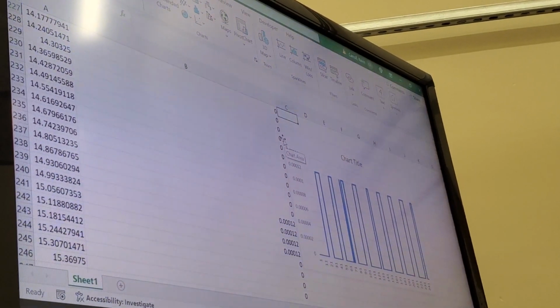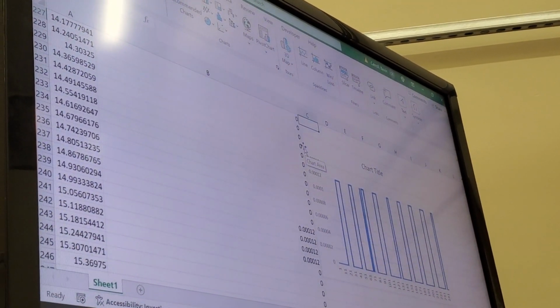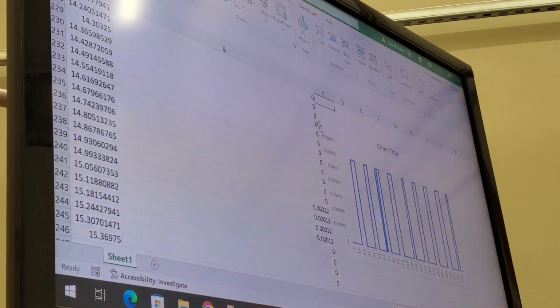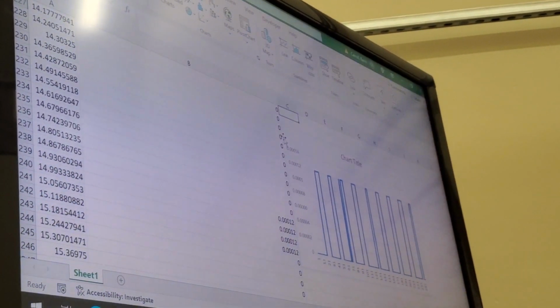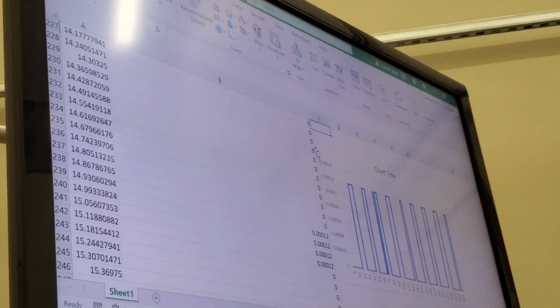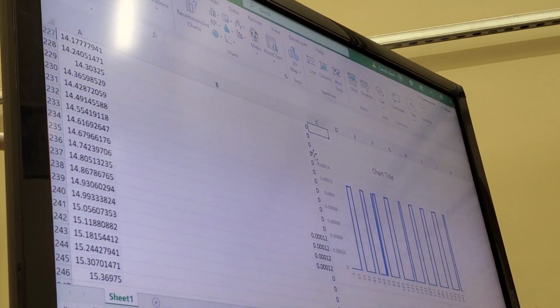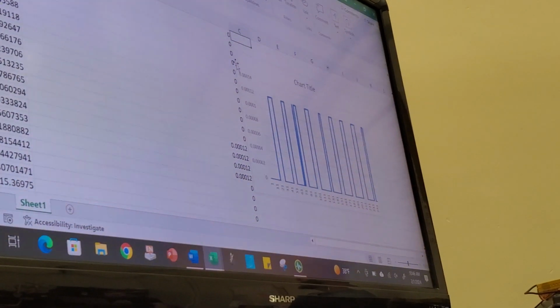It would be good practice though. Basically what I'm asking you to do is add to the Excel file that you created on Tuesday with the amplitude analysis, and just add additional tabs to it, so that we have one Excel file that contains all the data we need for that particular participant, so that we can calculate what we need and then pull it into a centralized data analysis file. We can run group analyses or a basic t-test, correlation, whatever type of statistics are necessary.